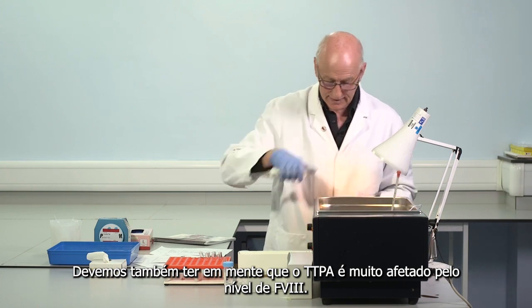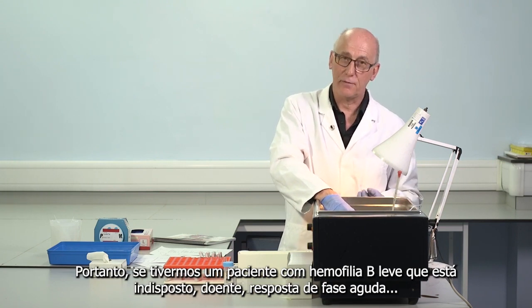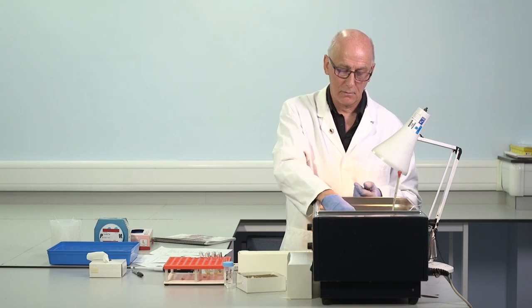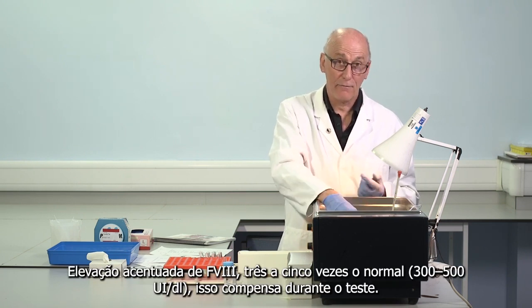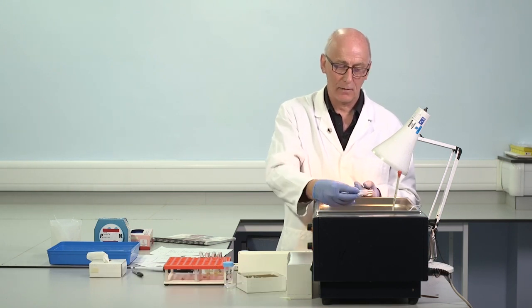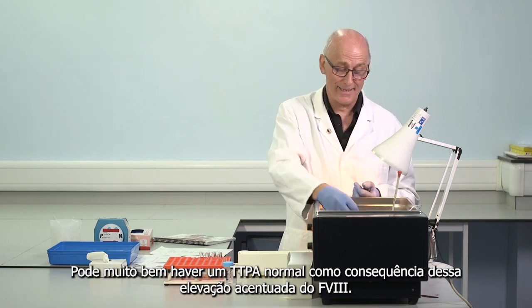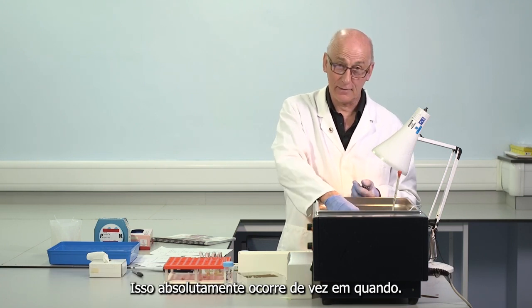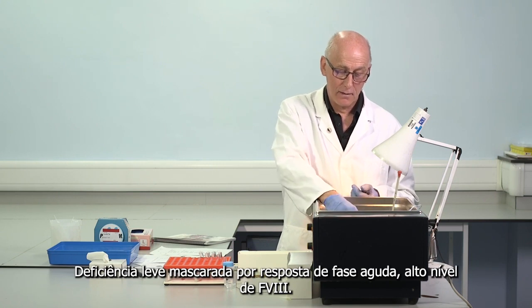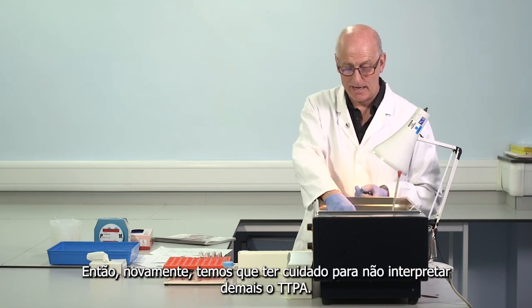We should also keep in mind that the APTT is very much affected by the level of factor VIII. So if we have a mild haemophilia B patient who's unwell, sick, with an acute phase response and marked elevation in factor VIII, 3, 4, 5 times normal, 300, 400, 500 units per deciliter, that compensates during the test. So even though the factor IX is 20, 15 units per deciliter, there could well be a normal APTT as a consequence of this marked elevation in factor VIII. This absolutely occurs from time to time. And the same problem occurs with factor XI: mild deficiency, masked by acute phase response, high level of factor VIII. So again, we have to be careful not to overinterpret APTT.